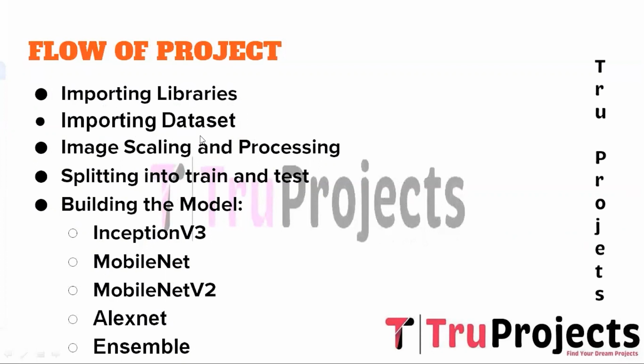And the second one is importing the dataset. The dataset consisting of medical images of knee joints affected by osteoarthritis is imported. These images serve as the input data for training and testing the deep learning model. And the third one is image scaling and processing. The imported images are pre-processed by scaling them to a standardized size to ensure uniformity across the dataset. Pre-processing steps include resizing, normalization, and image augmentation techniques to augment the training dataset and improve the model generalization.